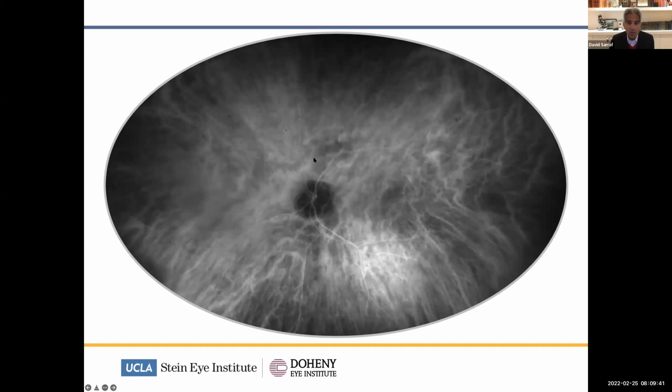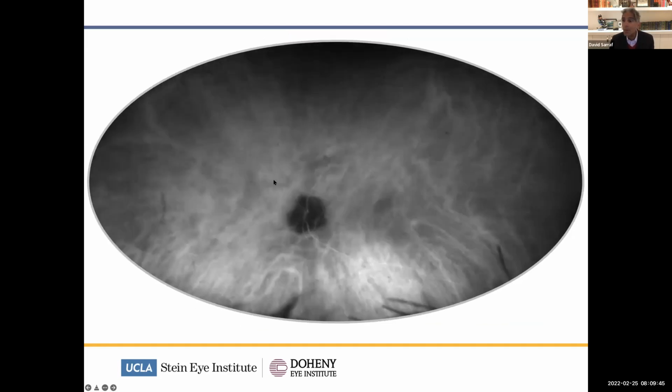Again, look at these large dilated vessels around the nerve that have choroidal hyperpermeability. You can see leakage of the ICGA dye. So this redistribution of choroidal flow, because of vortex vein obstruction, may be what's driving fluid leakage into the retina in this peripapillary distribution.